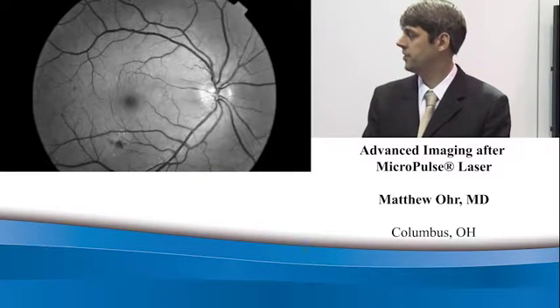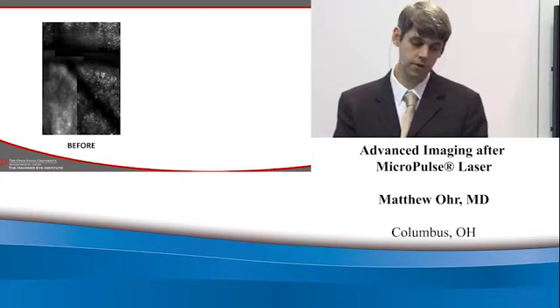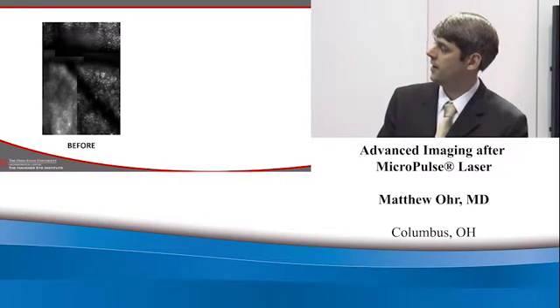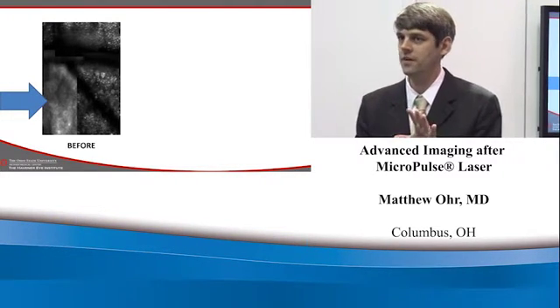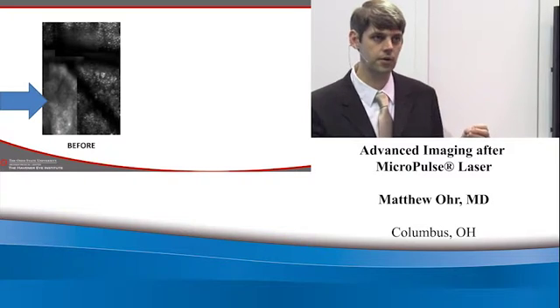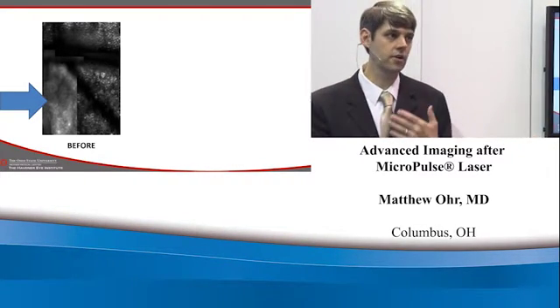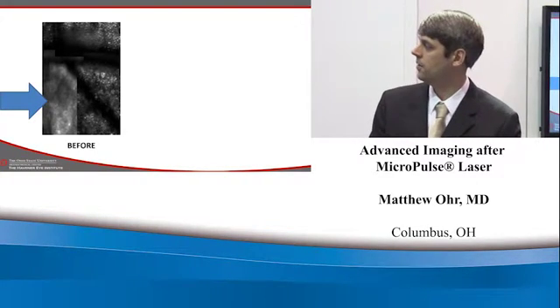So in our particular patient, we looked at where we had done that laser. And when we zoomed in, one of the things we noticed that was interesting is that before treatment in this area, and you'll see here with this blue arrow, the photoreceptor mosaic was very difficult to appreciate. In fact, it was very blurred. This was the area where the edema was, and clearly that would have an impact on what we were able to visualize in the retina. So before treatment, this is what we noted.